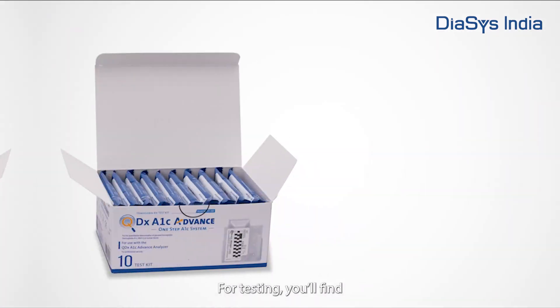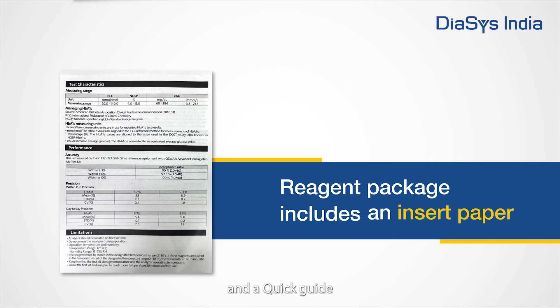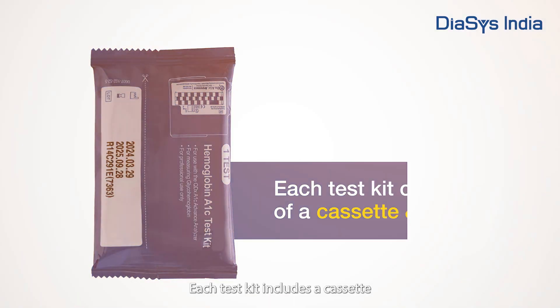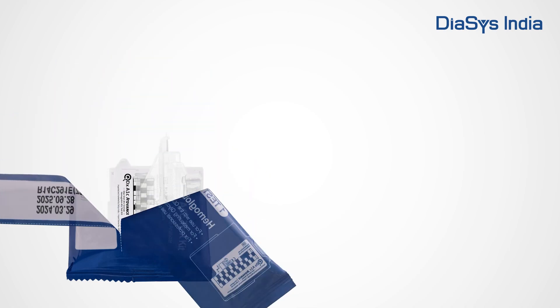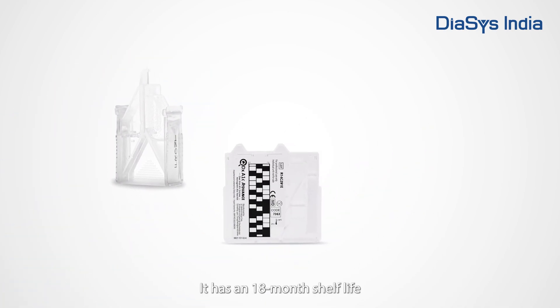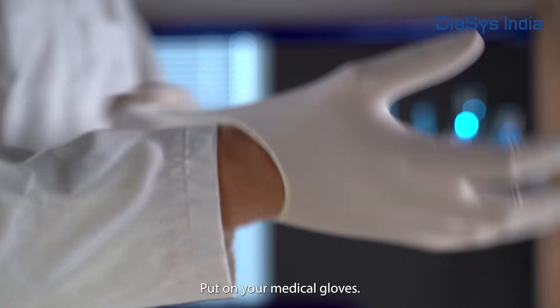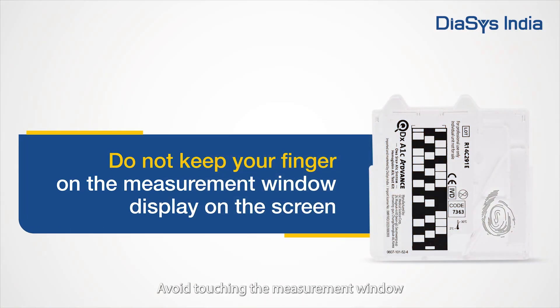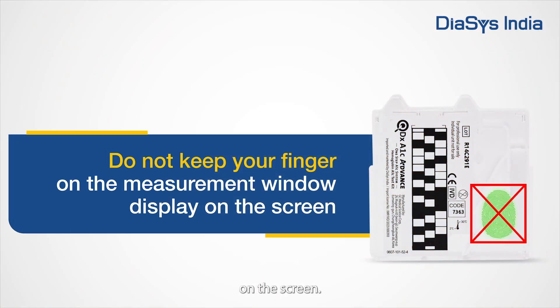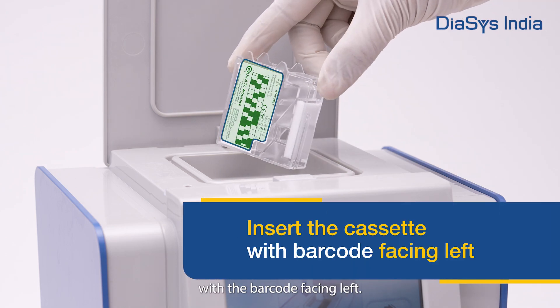Getting ready to test. For testing, you will find 10 test kits, insert paper, and a quick guide. Each test kit includes a cassette and reagent package. It has an 18-month shelf life and can be stored at room temperature. Put on your medical gloves. Prepare the test kit and use it within 10 minutes of opening. Avoid touching the measurement window. Insert the cassette with barcode facing left.